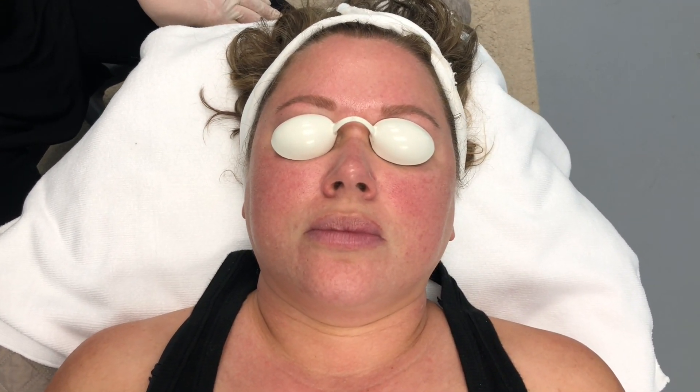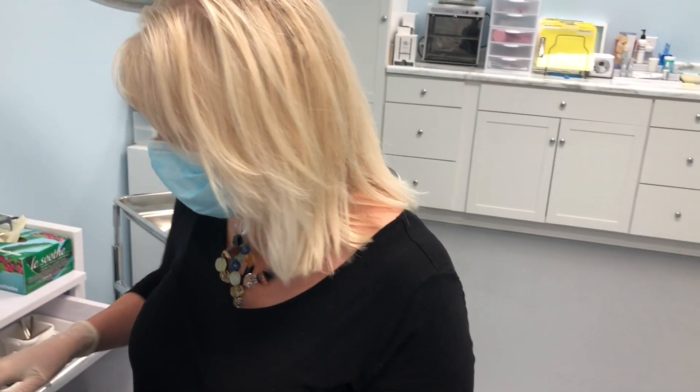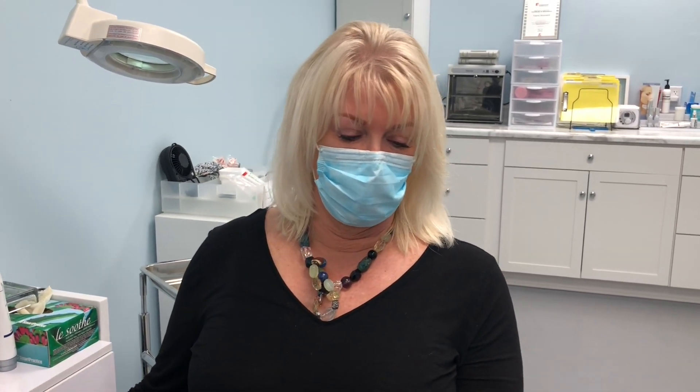Then we're going to go into the second phase of the 4D. A lot of times when I have people in for 4Ds, if they have some broken capillaries to clean up or they need a little laser hair removal around their chin or lip, this is a good time to work that in before moving on with the other steps. You can also do the acne protocol — whatever other issues they have going on, it's just a really easy time to get that taken care of.